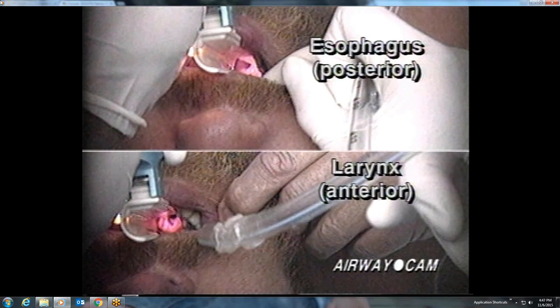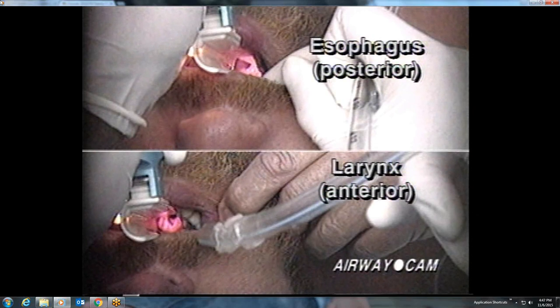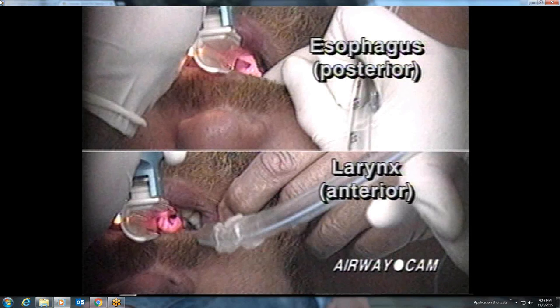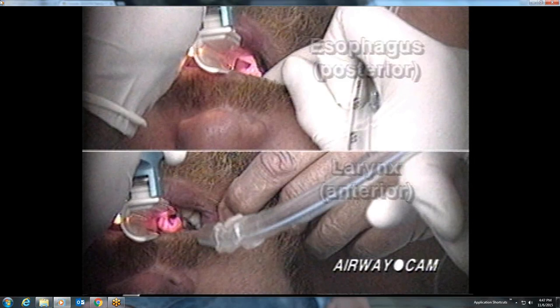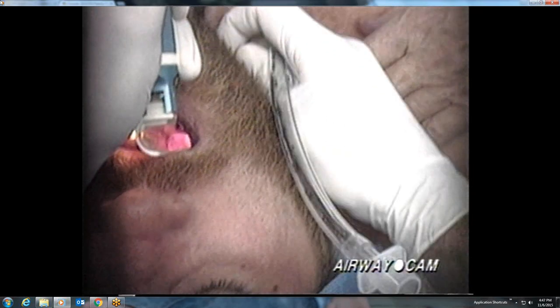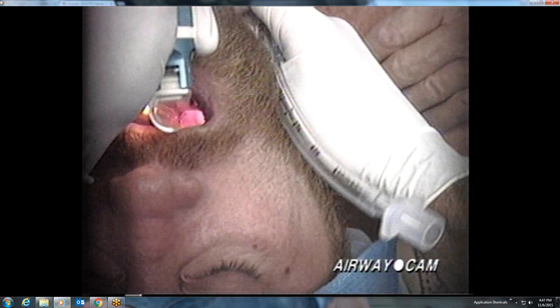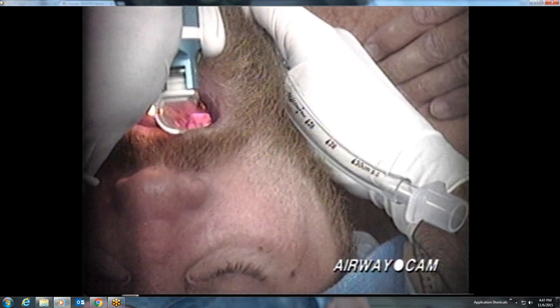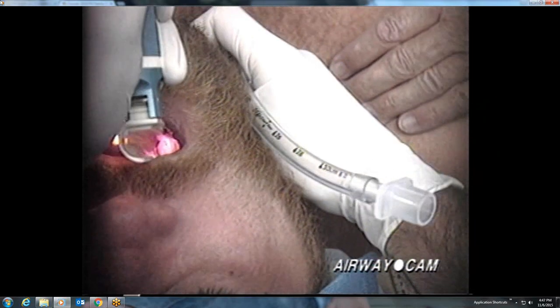As already discussed, the true vocal cords are often not well visualized during direct laryngoscopy. Recognition of the posterior cartilages adjacent to the glottic opening is a consistently dependable landmark for identification of the entrance into the larynx. In slow motion, let's take another look at the use of laryngeal manipulation by pressing on the thyroid cartilage on the anterior neck.